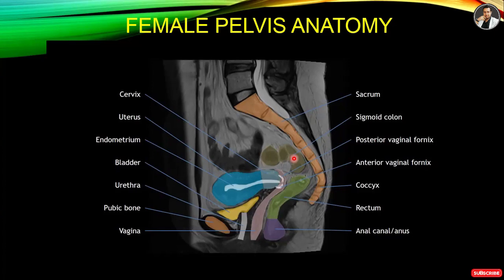But when the problem is in the rectum, the doctor advises us to plan the entire pelvis. We are confused. We have to plan the entire pelvis. But the main focus is on the rectum. The contrast is also on the rectum. We have to plan the entire pelvis.